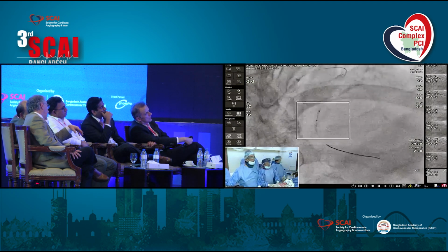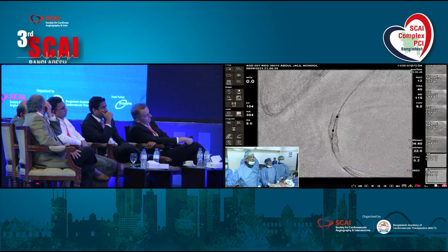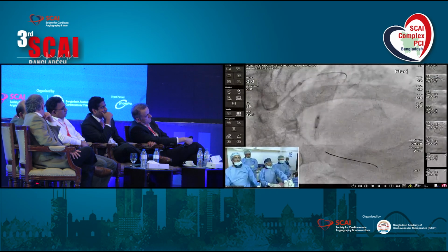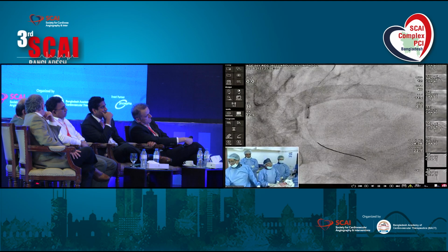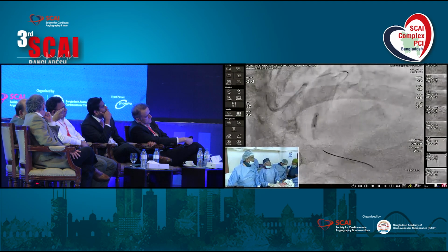So, sir, how much additional radiation does stent enhancement give? 12 times. Stent enhancement will give 12 times more than usual fluoroscopy. Usual cine, 18. More, straightforward. 12 times more.